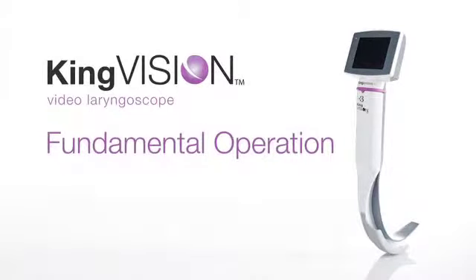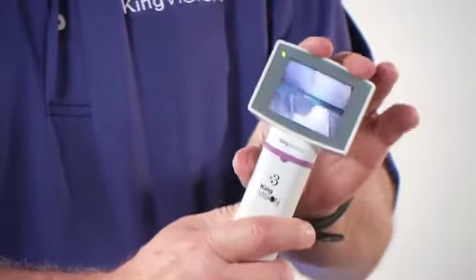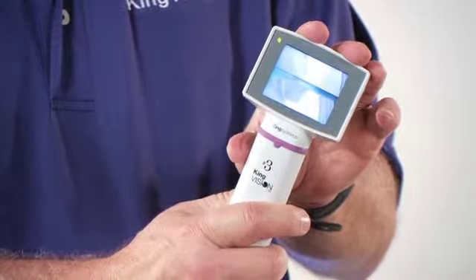In talking about the fundamental operation of the KingVision video laryngoscope, it's important to remember that because the imaging sensor is in the blade, you will not get an image on the display unless the two are connected before you power up. If you power up without the blade, you're not going to get an image. If you then attach the blade after the fact, you'll get a split image. To correct that, you just power off and back on again.